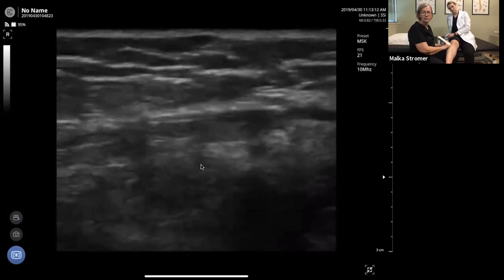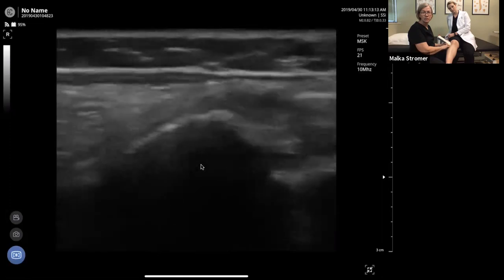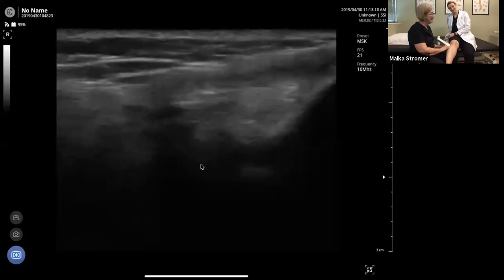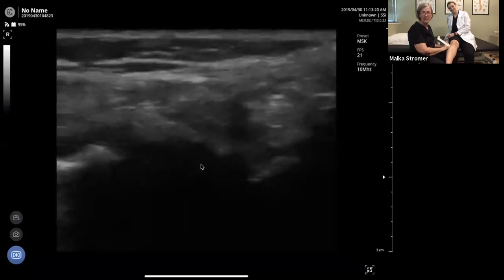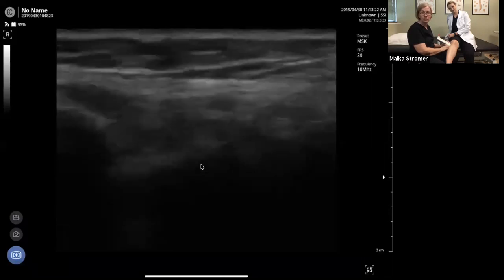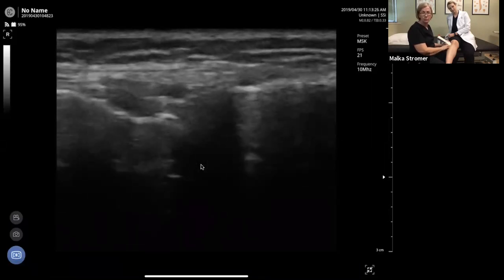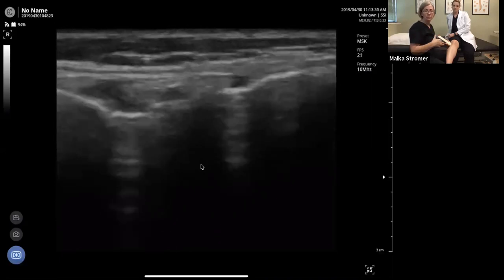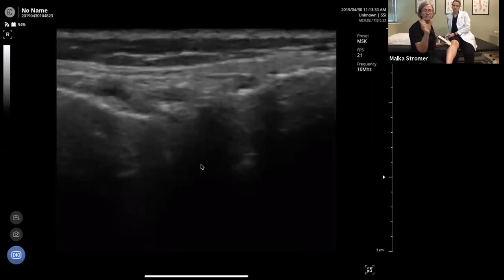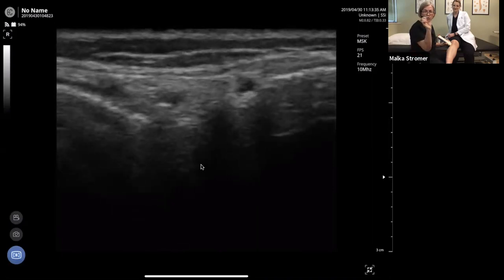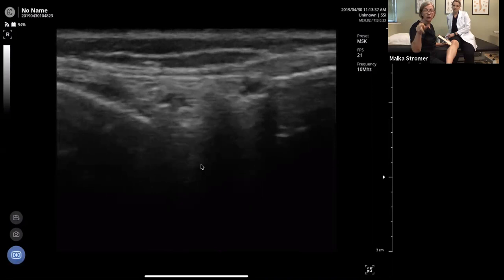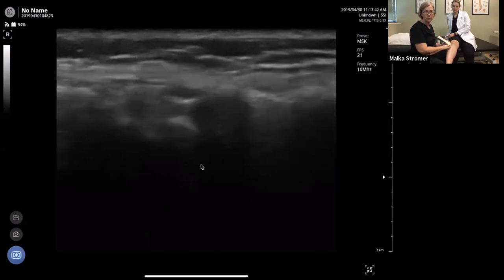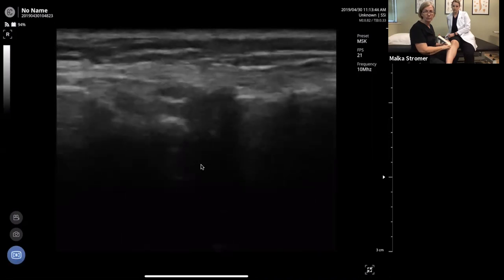Scanning through — this looks really nice. Her joint space is good through here. What you tend to see with decreased joint space is the meniscus will start to extrude from the joint. In the older population, the joint starts to shrink and the meniscus comes out, causing the ligament to distend from the joint, which can be quite painful.